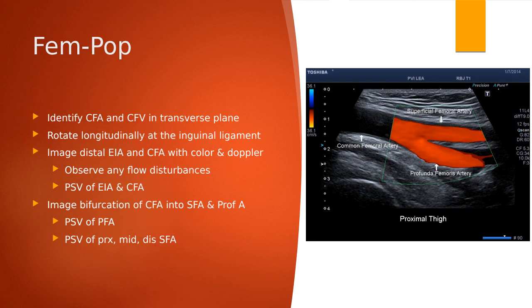So here we kind of have our standard inguinal region of where we're looking at these vessels in the legs. So we have our common femoral. If we were to scan up higher, especially in this picture here to the right, this region would be our external iliac. And we can kind of tell because this right here is the hip joint. So that bone right there is basically saying, hey, here is where my pelvis meets my leg. You know that if you're higher up above that hip joint, that's going to be your external iliac artery.